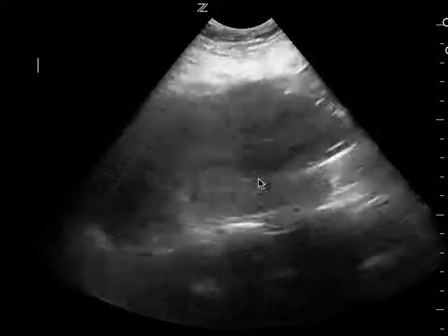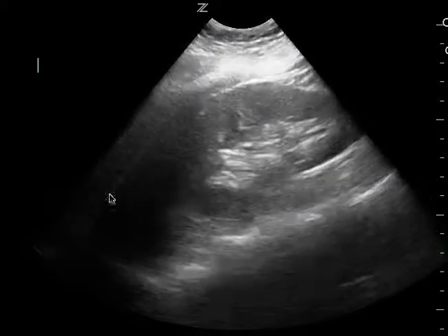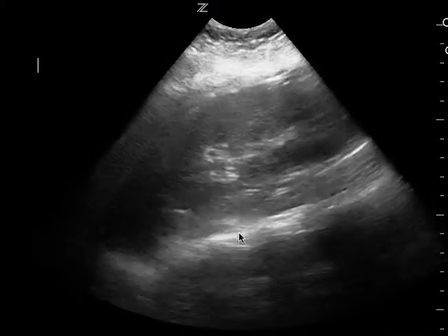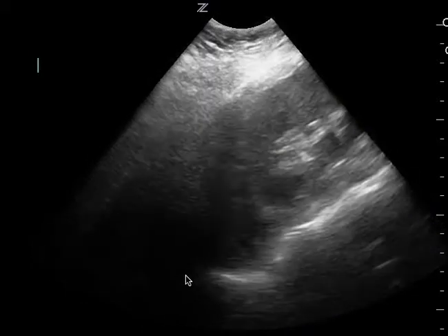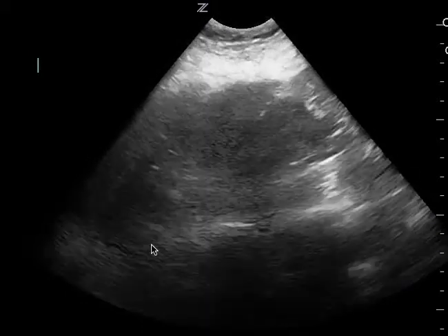And it's the same thing here and on your third view as well. For the most part you can see what you need to see. And in the beginning of this clip you can tell that there's no free fluid in the spleen or renal space.